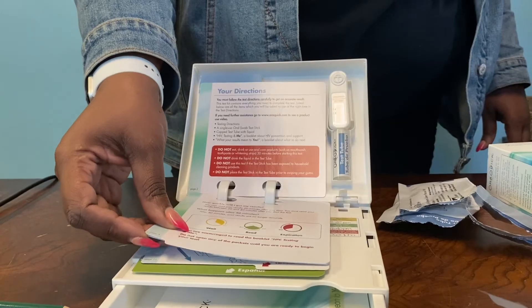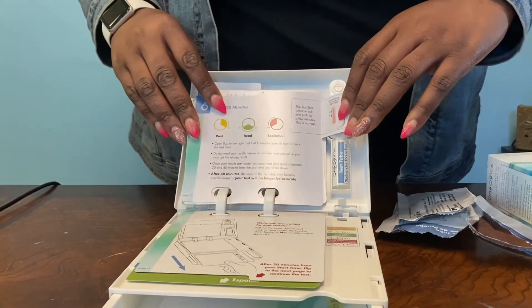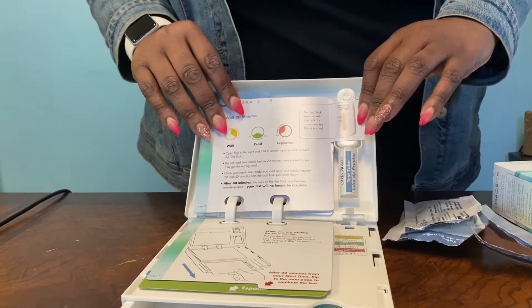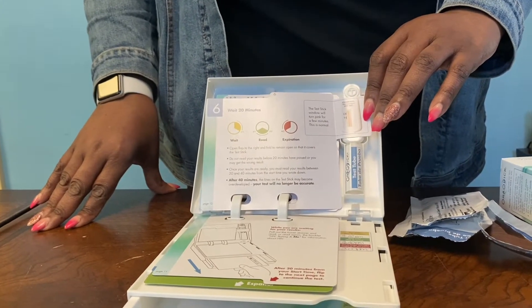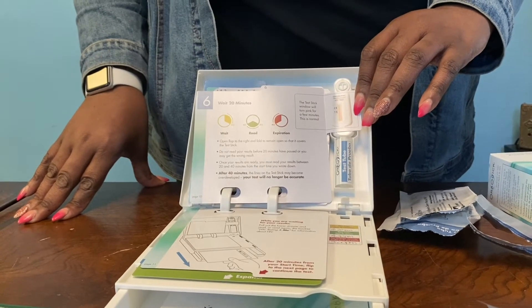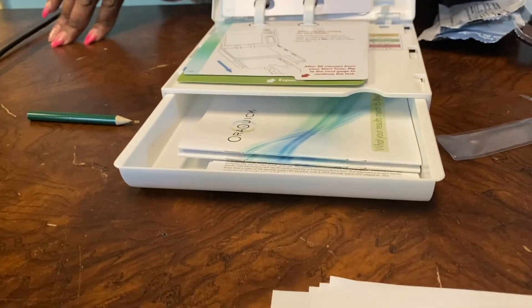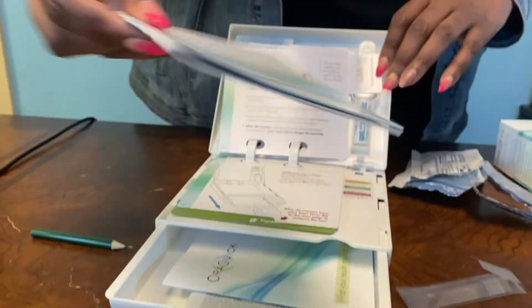Now open the flap and fold it to remain open so that it covers the test stick. You will find the flap on page six of your instruction guide. The test stick window will turn pink for a few minutes — that's okay, that's how the test works. Now while you wait 20 minutes for your results, read the booklet 'HIV Testing and Me' for information about HIV.